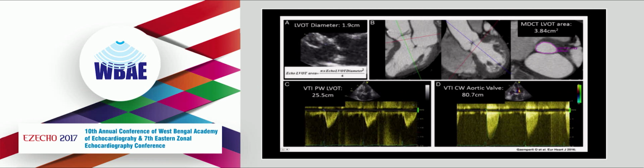You can also look at aortic stenosis. One of the big advances of CT here has been traditionally for aortic valve continuity area, you use the outflow area assuming that to be a circle, but CT has shown very often it's not a circle but an oval, and you can get the outflow area very well. If you substitute CT outflow area instead of echo outflow area and calculate aortic stenosis, very often the valve area appears to be higher, which suggests that echo is underestimating the valve area.